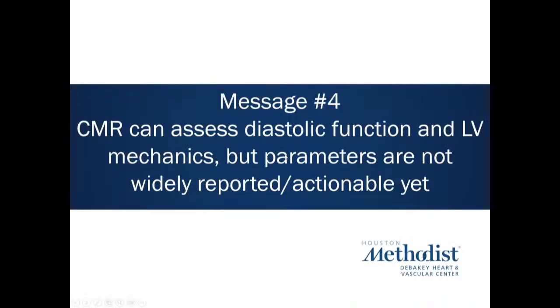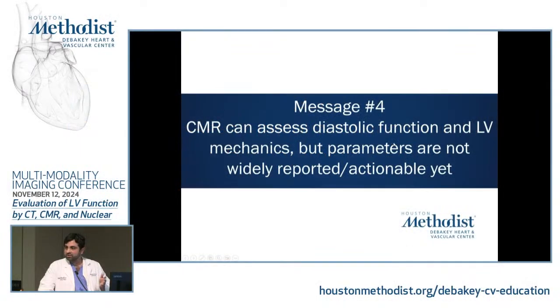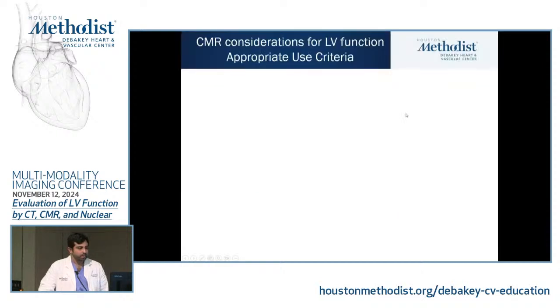So, my fourth message is you can assess diastolic function, you can assess LV mechanics. There are many advanced techniques to look at vortices within the LV, like I showed you earlier, and then obviously there's an AI aspect to all of this now. That's a very big deal. But currently, we're not routinely reporting and using all these parameters.